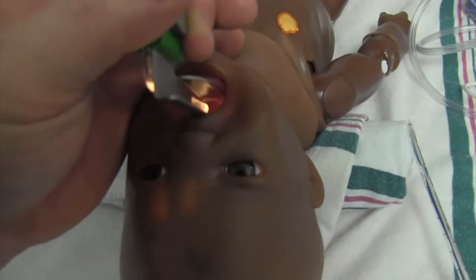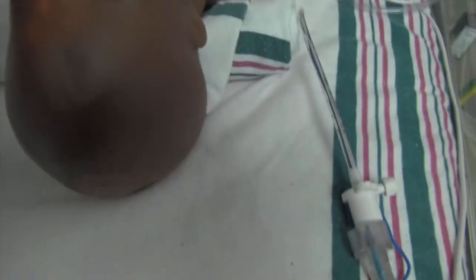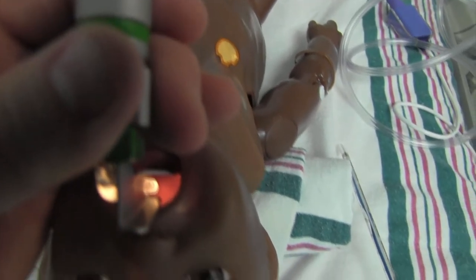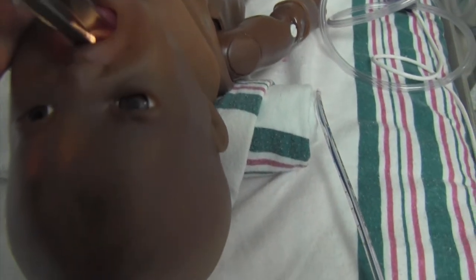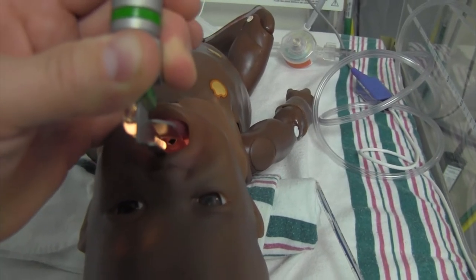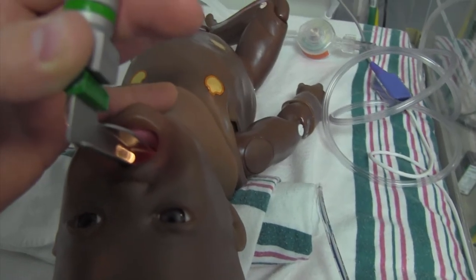If I go in here and look, there's a little flap of skin - it's hard to see the epiglottis in this little dude. But if I go around on the other side of it, there it is. If I push down on it you can see it, then go around it, lift up, and look back in - I'm going to see my cords there. Now watch - if I put a little pressure on my pinky, it does bring the view down a little bit more. That's just a little bit of cricoid pressure using your pinky. It just makes it stick out a little bit more.